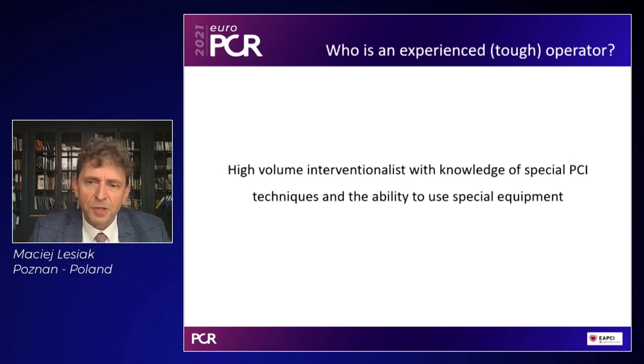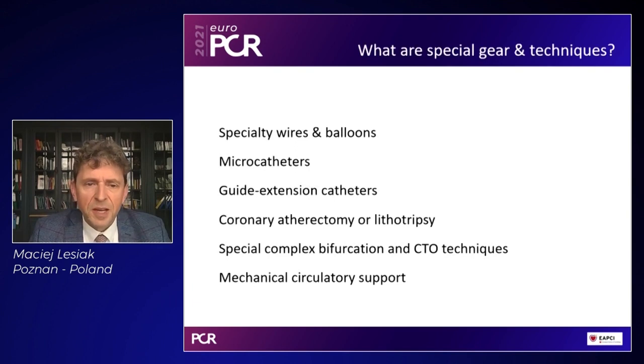So who is an experienced, or I call it tough, operator? I think that's the high volume interventionalist with knowledge of special PCI techniques and, what is very important, the ability to use special equipment. What is special equipment? We all know the specialty wires and balloons, the microcatheters, the guide extension catheters, coronary atherectomy or lithotripsy devices, some special complex bifurcation and CTO techniques, as well as mechanical circulatory support.